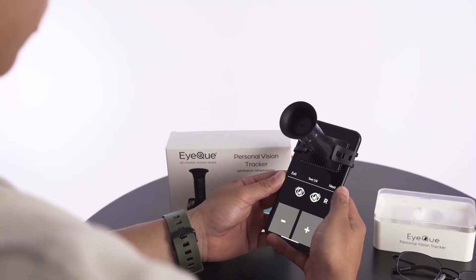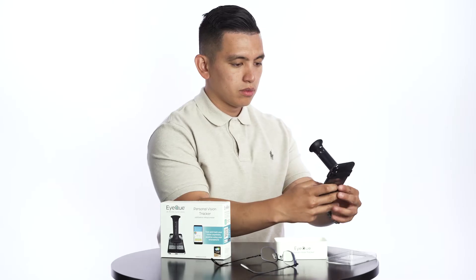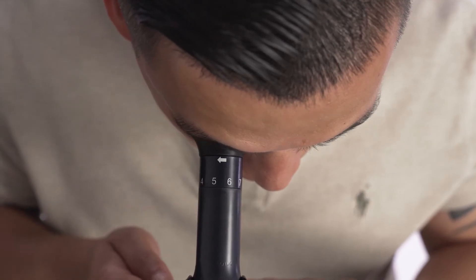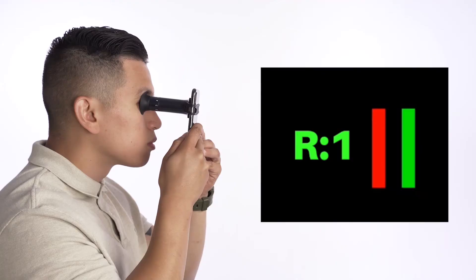Once you're ready to start your first vision test, hold your phone at a comfortable reading distance like holding a book. Slowly move your device to your eye until the soft eye cup touches your eye. Through the device, you should see R1, indicating that it is your first measurement with your right eye.